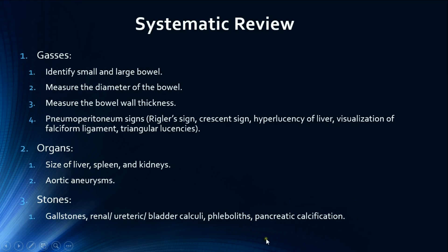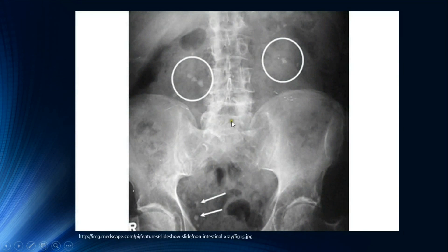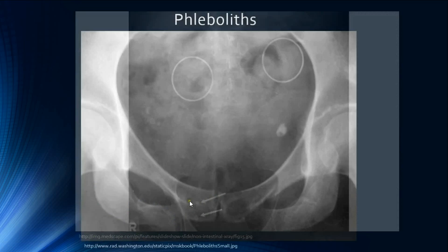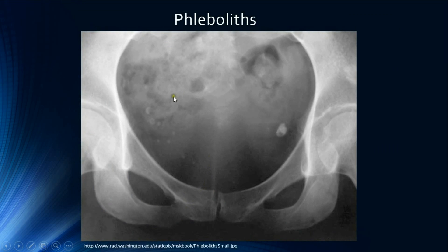Gallstones are usually radiolucent and therefore not visible on abdominal radiographs, whereas most urinary stones are radio-opaque and visible. Here is a KUB showing renal stones as small opacities bilaterally — the right kidney is slightly lower than the left. There are also phleboliths indicated by white arrows in the pelvis, which are venous calcifications.